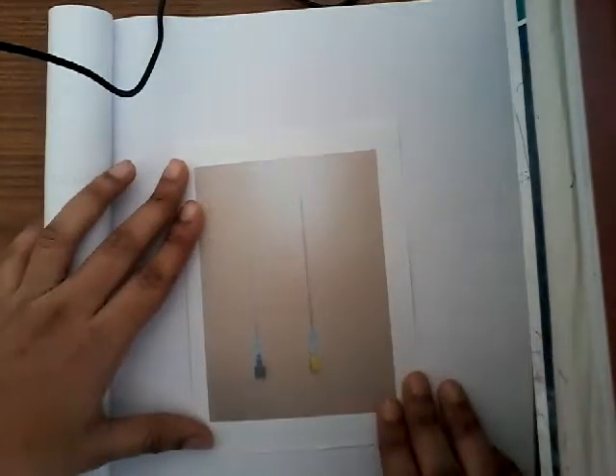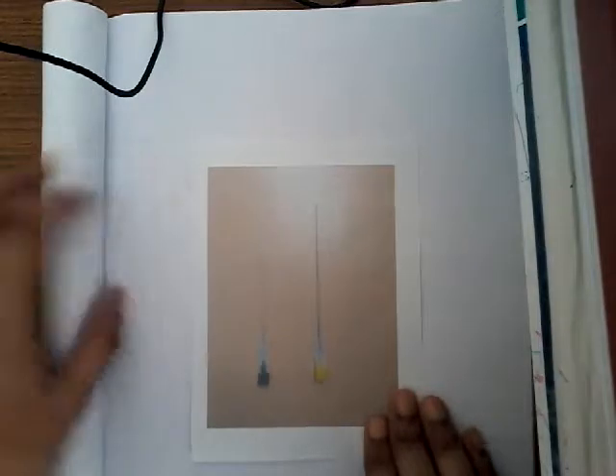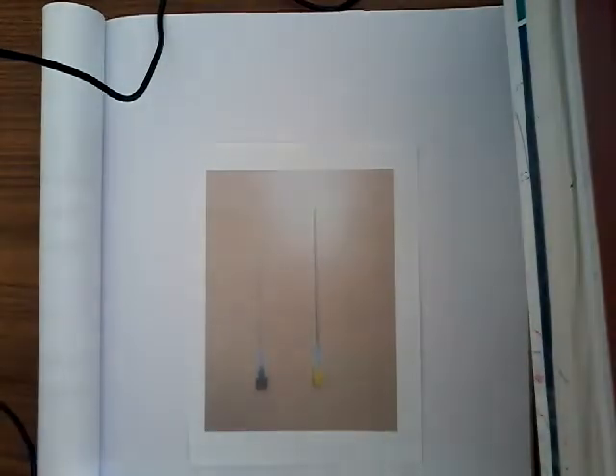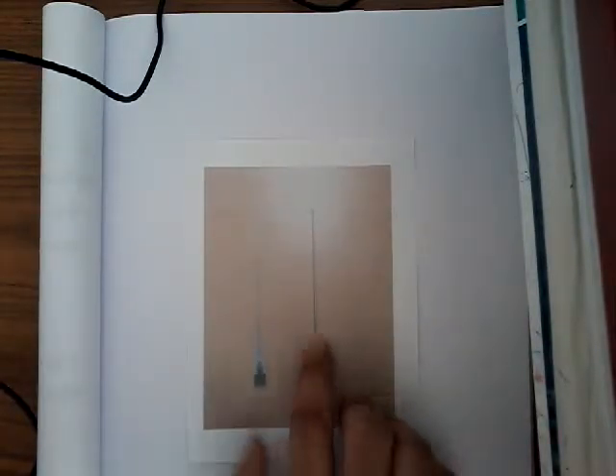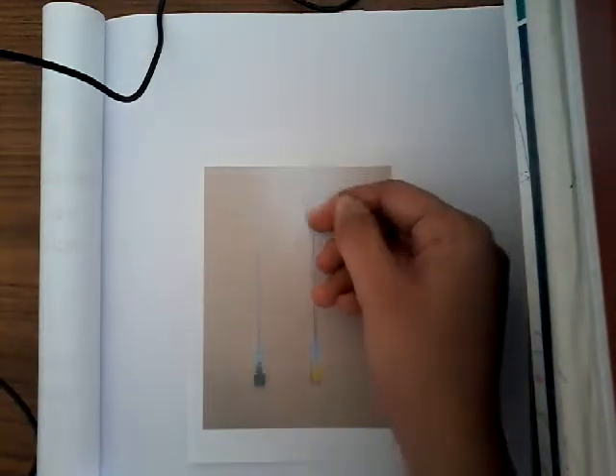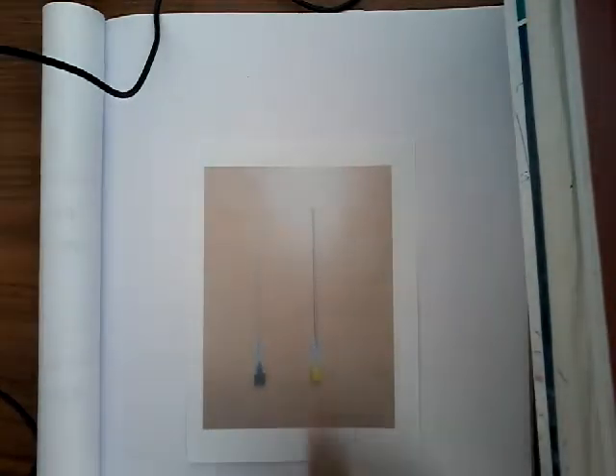Hello friends, welcome to a new lecture today on lumbar puncture. This is a practical session. This is the lumbar puncture needle — I don't have the instruments with me, so I'm just showing you pictures. The lumbar puncture needle has a stylet, and the base of the needle has a notch so that it can accommodate the stylet.